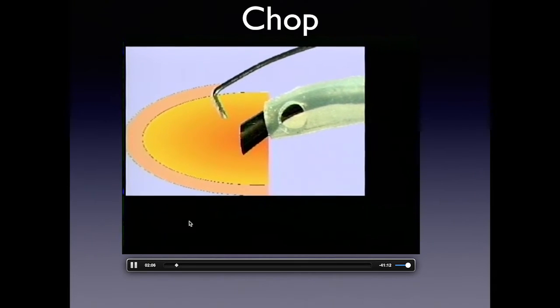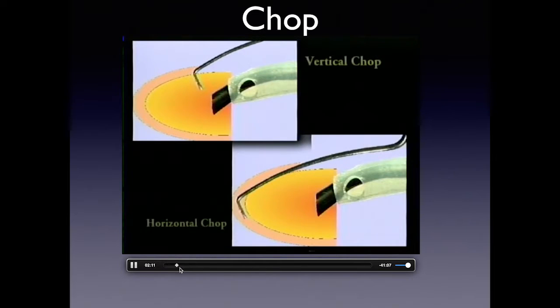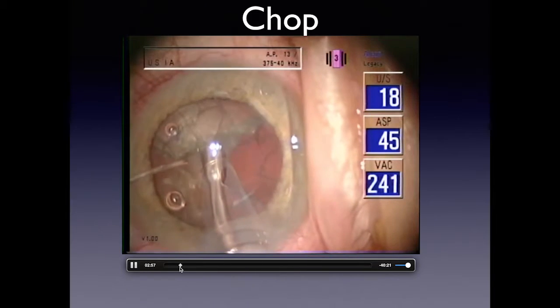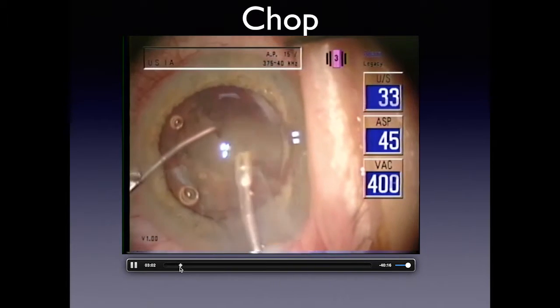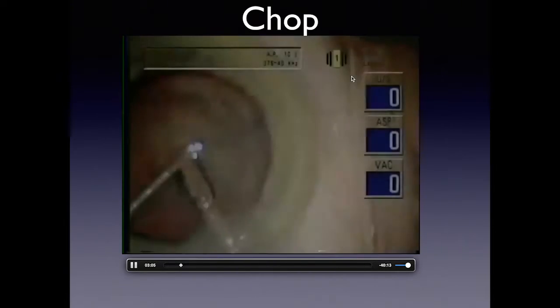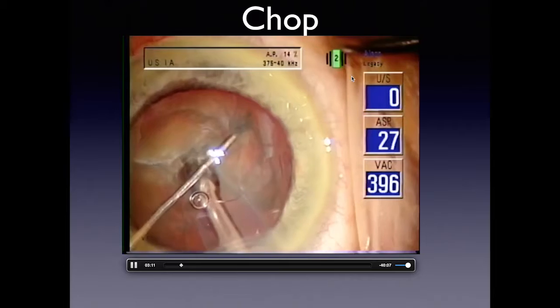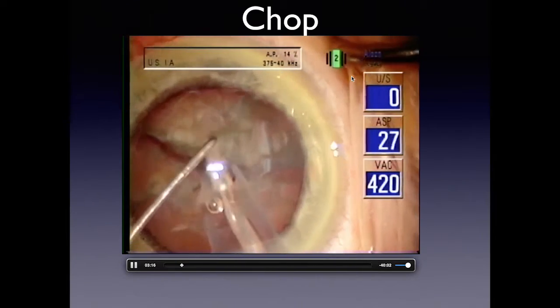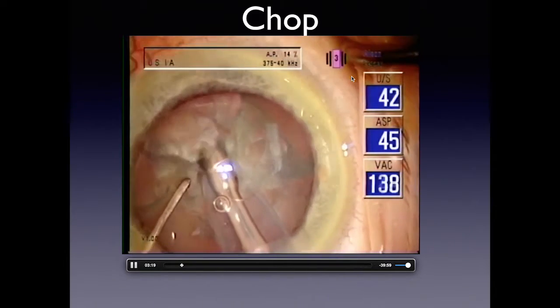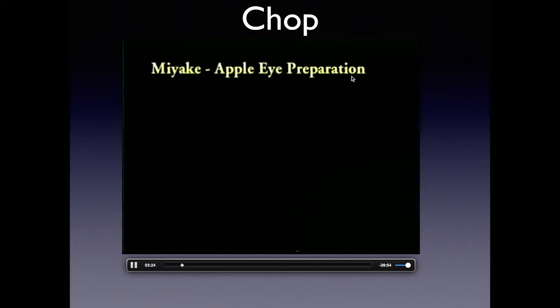It's important to understand both vertical and horizontal chopping and what foot positions to use. Different choppers for different modalities — here is a horizontal chop where the phaco handpiece stabilizes the nucleus while the non-dominant hand draws the chopper toward the nucleus and out, splitting it. This can be hard; in that case I rebury the tip a little deeper and slowly go down, splitting pieces into different quadrants. The non-dominant hand is what actually cracks the nucleus.